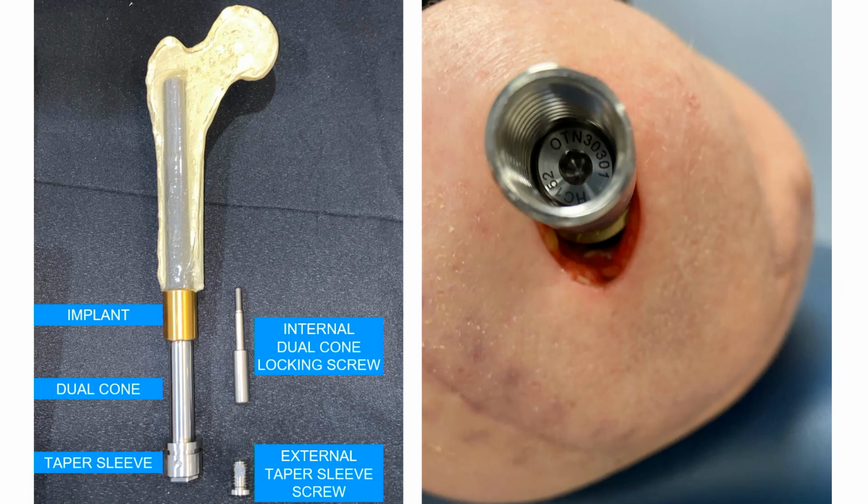A more simple approach, and the reason why I'm showing you this, is if you're going to work with us with osseointegration, or I'm going to work with you with osseointegration, it's important to know these 2 screws. We will definitely tighten the outer screw, and then we do again have to make a decision on whose role it is for that internal dual cone screw. The manufacturers say it's the surgeon's role, but again, that's not reality in my opinion.